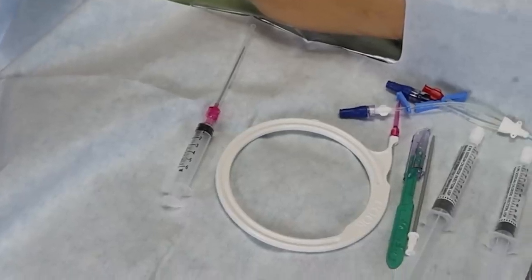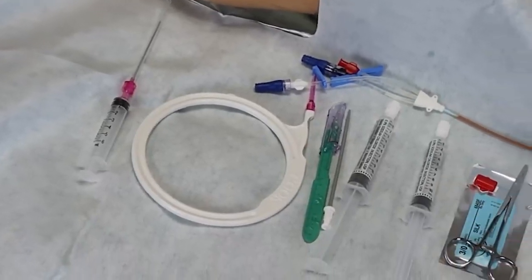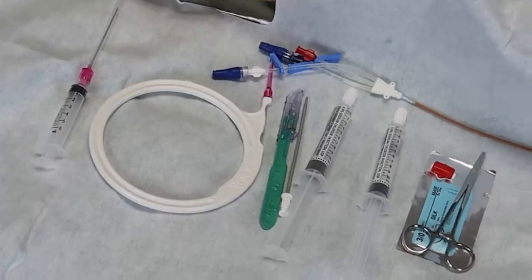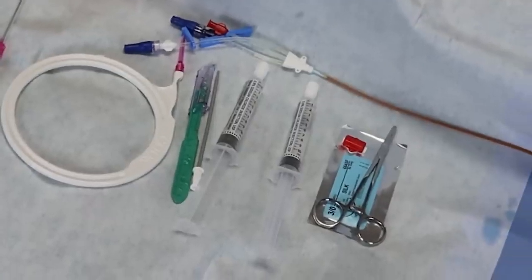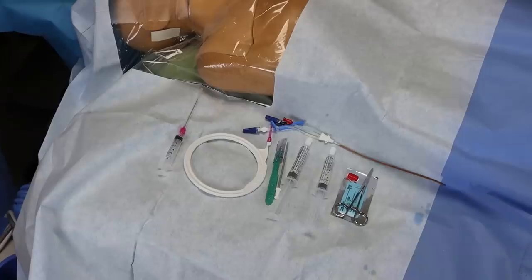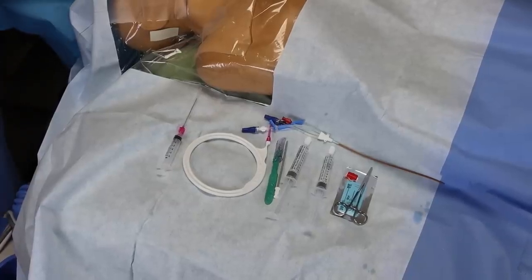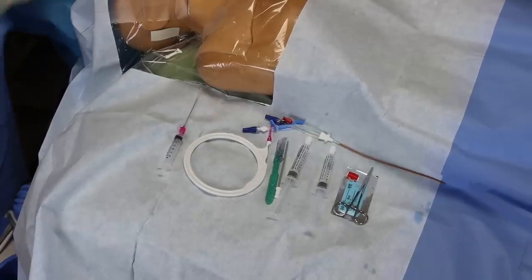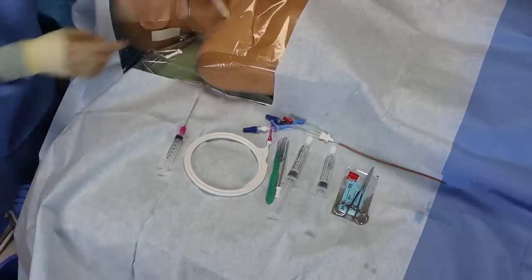the order should be the finder needle attached to the syringe, the guide wire, a knife, the dilator, the catheter, saline flushes, and then finally the things you need to sew it in. So the needle drivers, the suture, and the catheter fastener. Personally, I really like staging on the sterile field itself next to the patient. It leaves the tools within arm's reach and I don't have to look away to grab them. The Mayo stand would be just fine too, especially if the patient is squirrely and you're afraid they may bump your equipment.